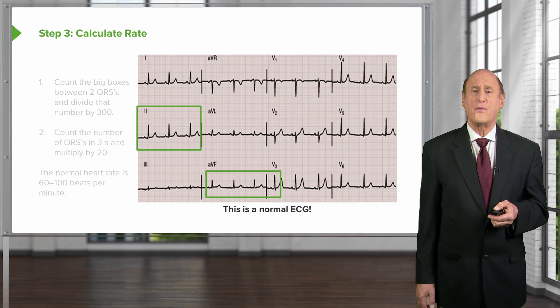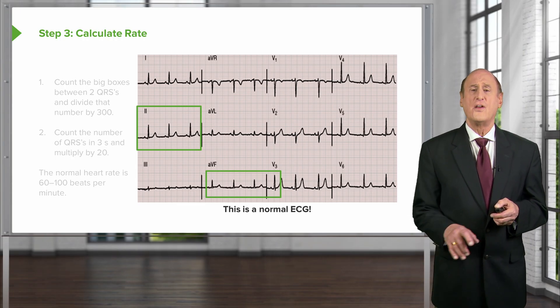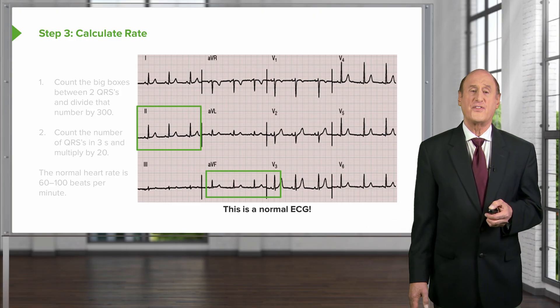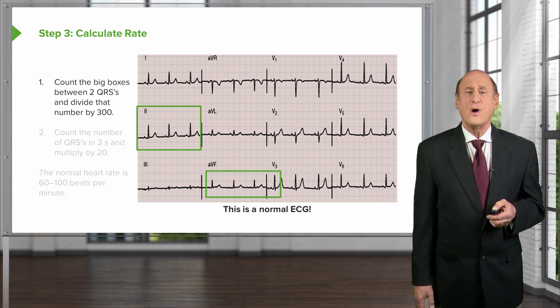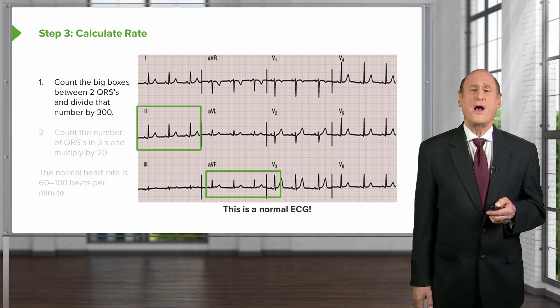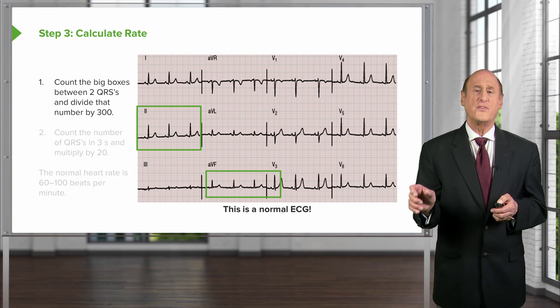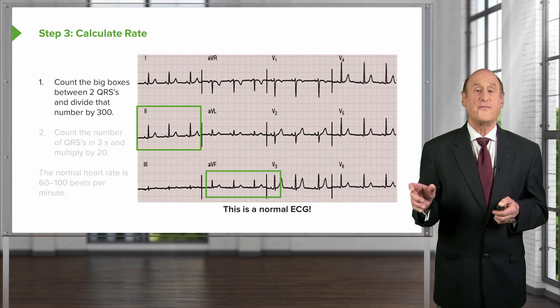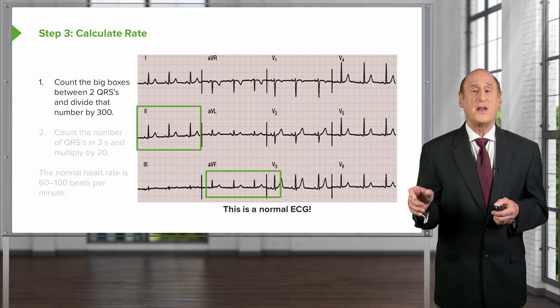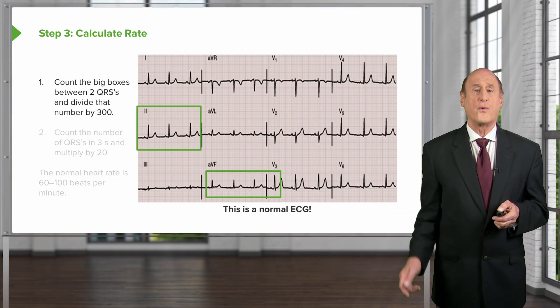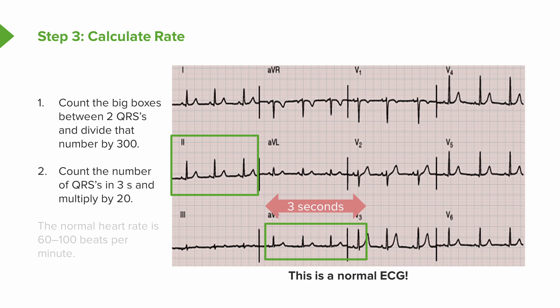Notice how nicely the QRSs progress. That whole strip along the bottom is continuous, so you're actually seeing one set of P waves after another. In order to obtain the heart rate, you count the number of big boxes between two QRSs and divide by 300. Two big boxes gives 150; three big boxes gives a rate of 100; four boxes gives 75. You can also count the number of QRSs in three seconds and multiply by 20, but usually we use the rule of 300.